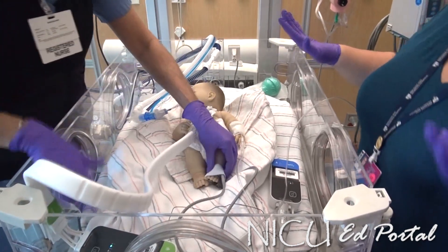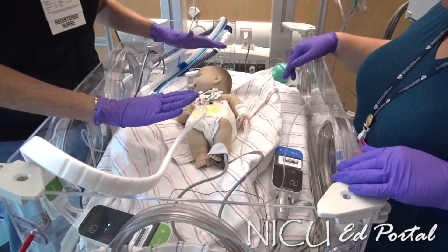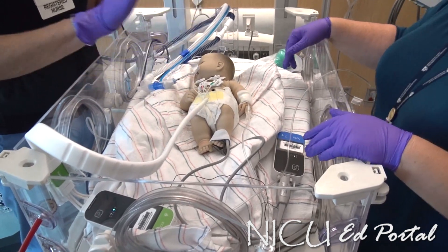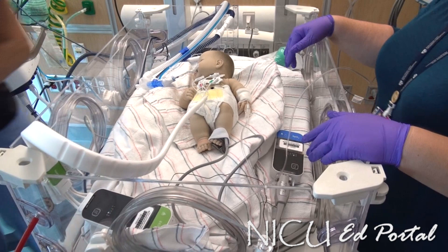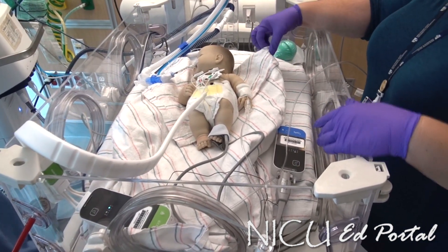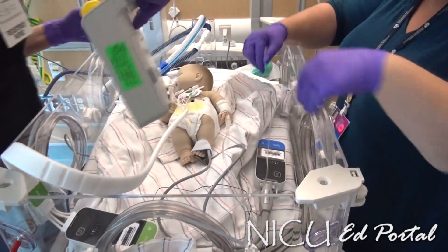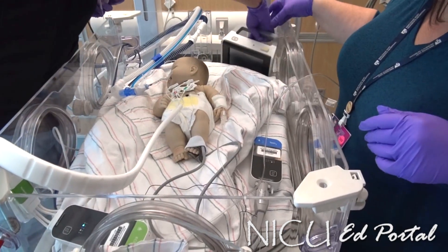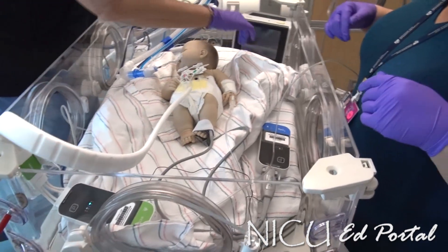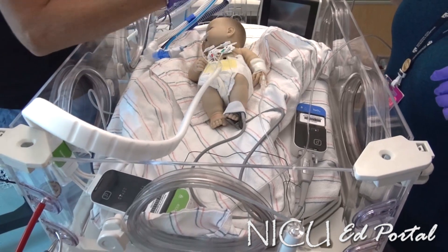We now have cardiac monitoring and the SpO2 monitor. The other thing we want to do at this point is get everything on him, because once we get into the suite we're going to put him in directly. This portable monitor is in the bed and it's picking up his O2 and heart rate from the O2 monitor.